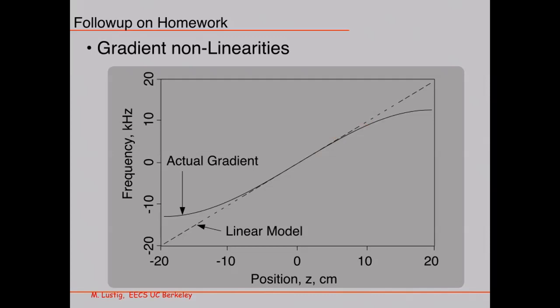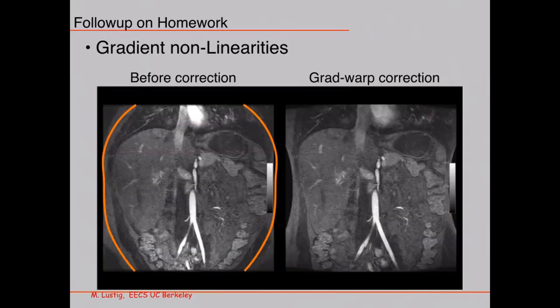Right? This actually happens a lot, and this is an example of a body. This is a coronal cross-section through a pediatric patient body. So a coronal is kind of like as if I would slice myself like this. Okay, and this is a coronal section. This is the liver. This is the bottom of the heart.